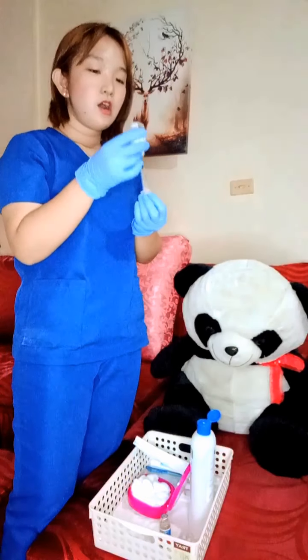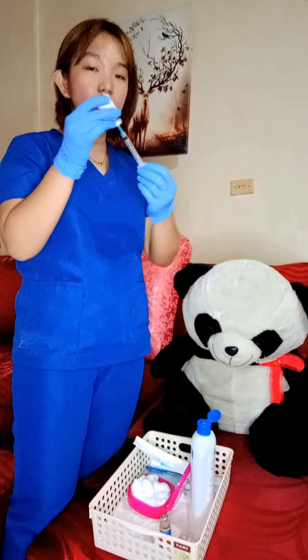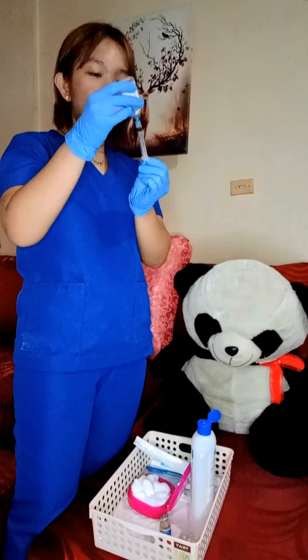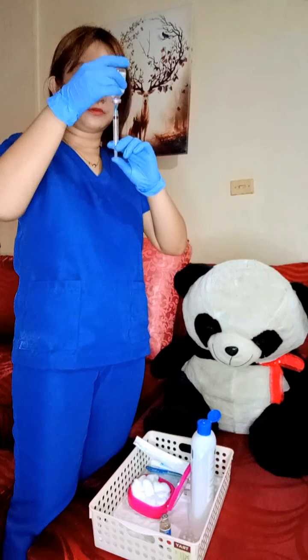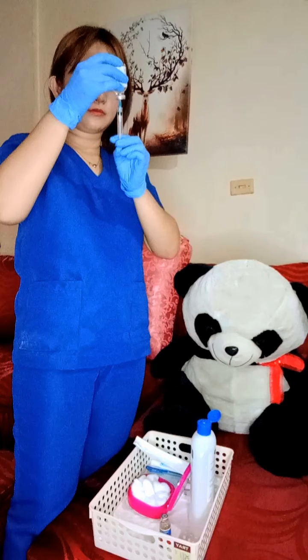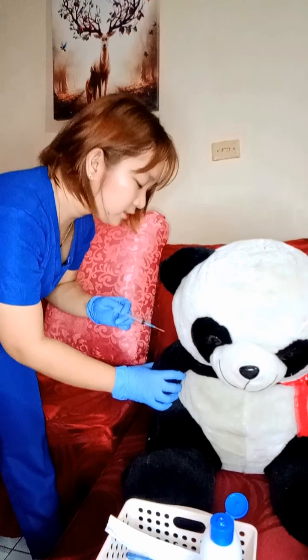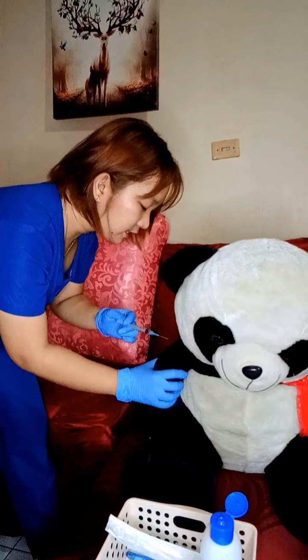Then hold the barrel carefully using the non-dominant hand, and using the dominant hand, pull the plunger as you aspirate slowly. Now we can inject the medication slowly and carefully at a 90-degree angle.